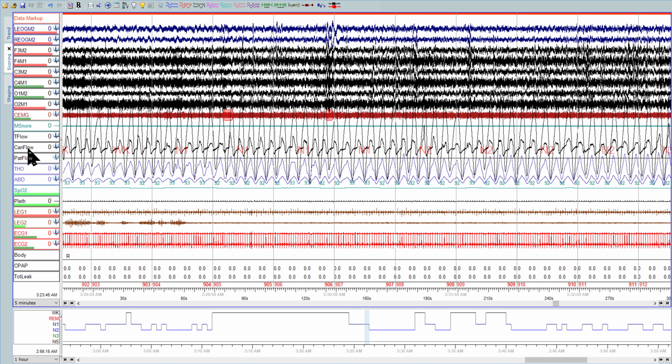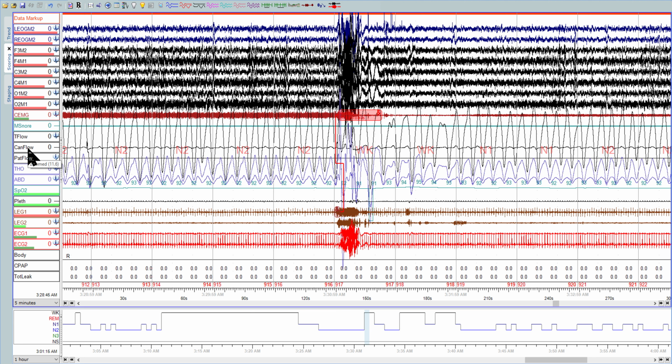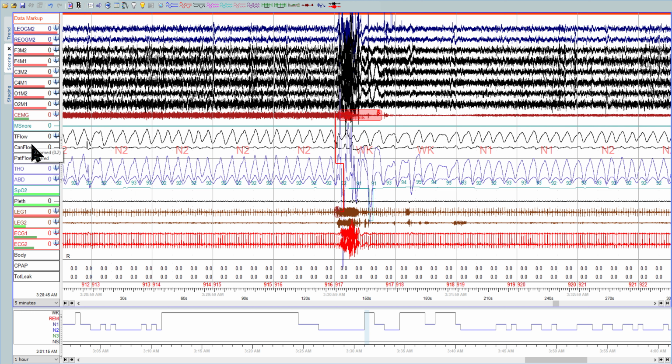It looks like I'm gonna have to decrease this line here. Oh, this line here. Coming in hot.